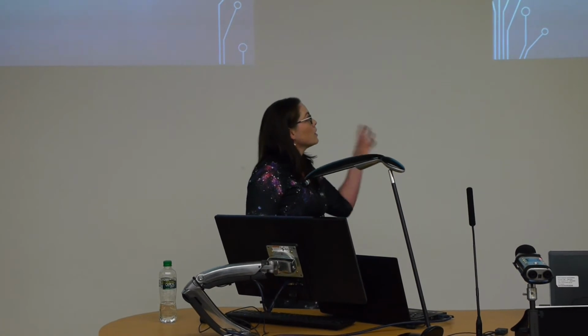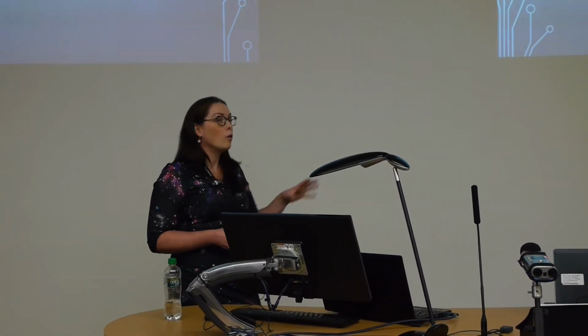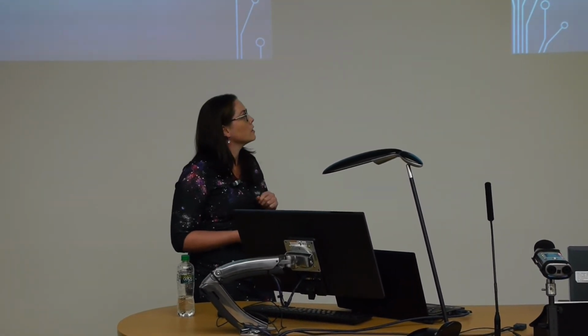So that's all well and good, and your plan looks great, and then your patient comes for treatment. So how do you know that their tumour looks like what it did when you CT'd them 2 or 3 weeks ago? So this is where this on-treatment imaging comes in. So ensuring what you plan is what you get in a patient.